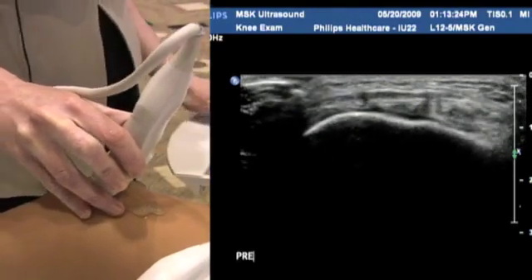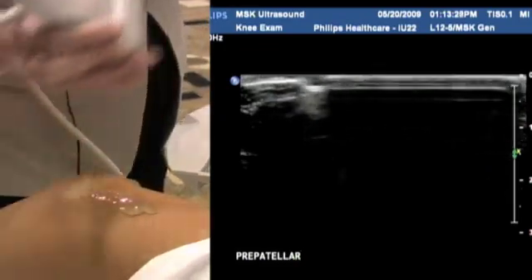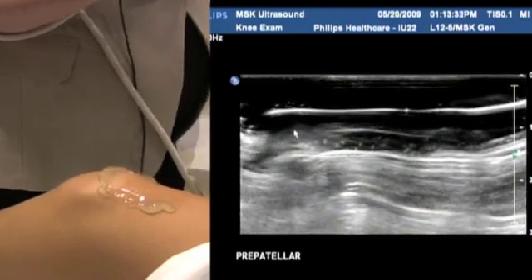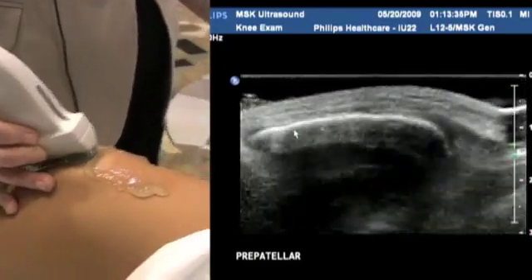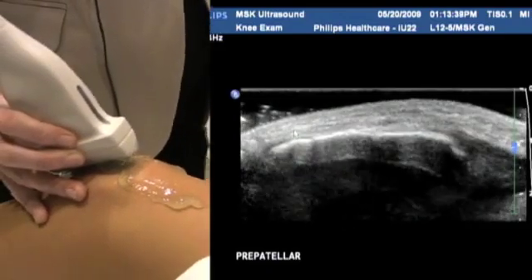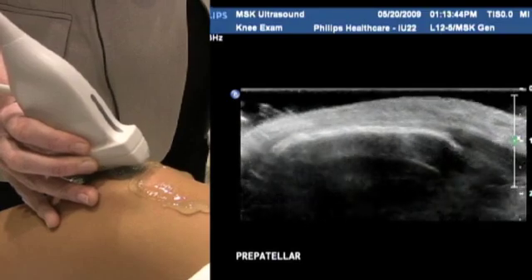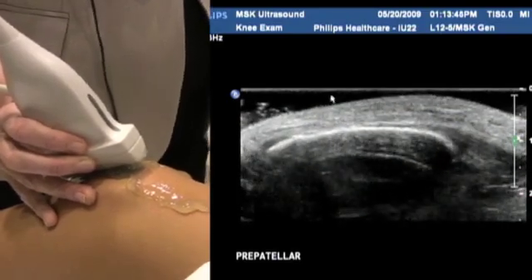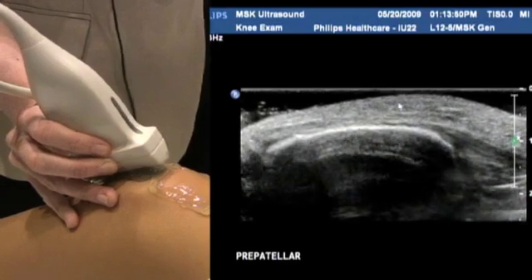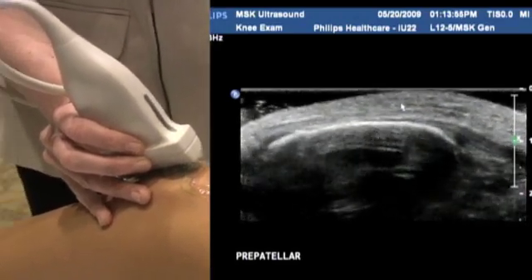We're going now to the pre-patellar area of the knee. There is a bursa that lives in this spot. Patients will invariably present with inflammation or a bump on top of their knee. You need to use a fair amount of gel for the pre-patellar portion. You can see here I've got a little bit of a standoff created by the thick gel, because the pre-patellar bursa, it sits in this subcutaneous region above the patella tendon or the patella ligament.